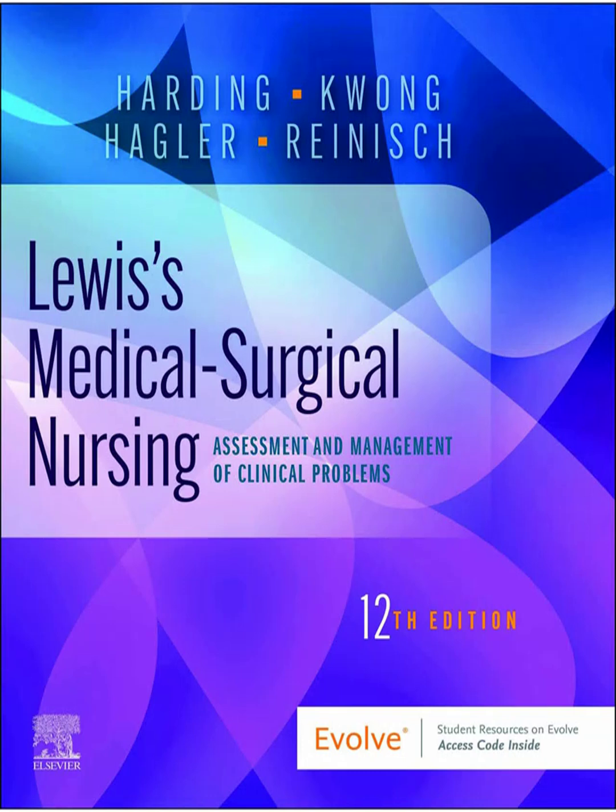Okay, defib for VF, pulseless VT. Sync switch OFF, shock, then CPR. Got it. What about cardioversion? Synchronized cardioversion. This is different.